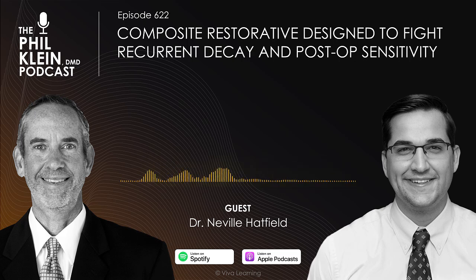Yeah, and I think it's a safe bet to stick within the same company when you're using a bonding agent and the restorative material on top, just because you know it's from the same company, and the compatibility, you would think, is greatly tested, versus using your favorite bonding agent that claims to be universal, which it might be, and then using a Giomer type composite that Shofu sells on top of that. So the fact that you're having good success with the bonding agent does give you some peace of mind as far as compatibility. What do you think the charging capacity is over time when you put the restoration in?